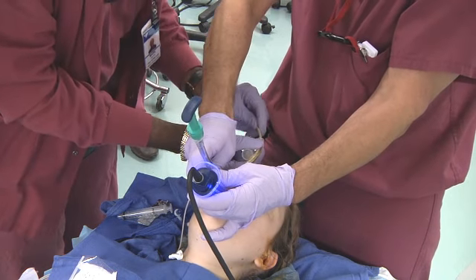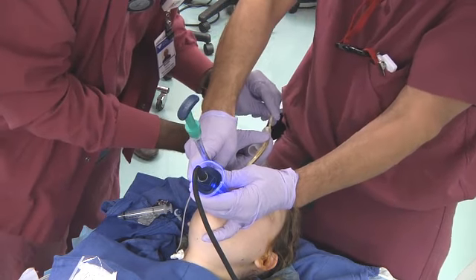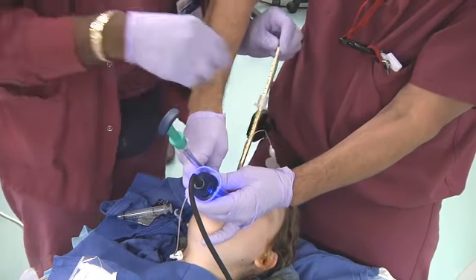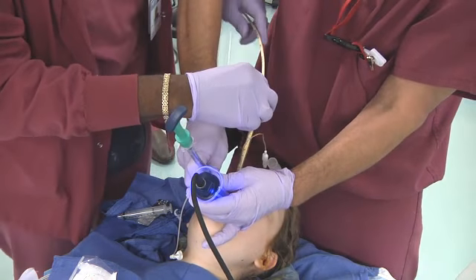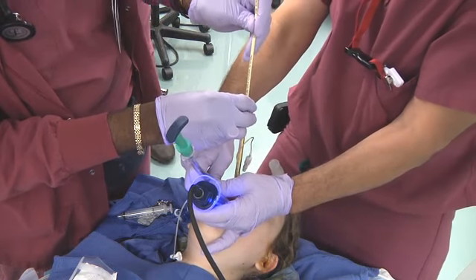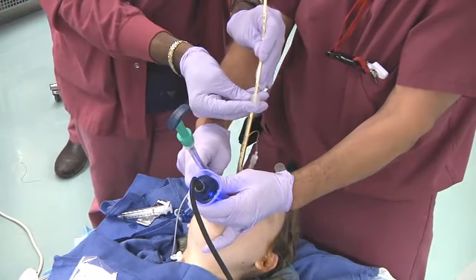An airway exchange catheter has been placed through the in situ nasotracheal tube. The airway exchange catheter is inserted only as deep as the nasotracheal tube. This will assure that once the nasotracheal tube is removed, the end of the catheter is sitting mid-trachea.